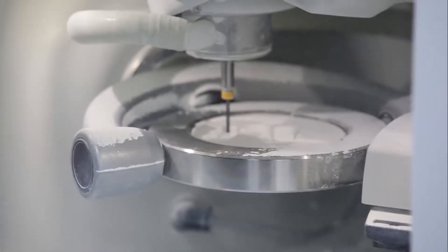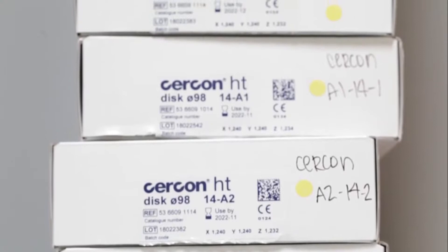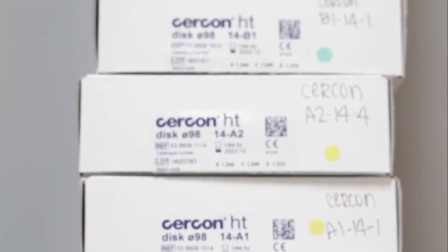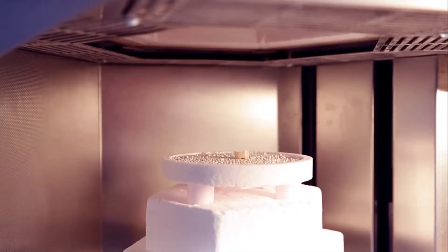So we decided to test out a lot of different materials in the market and find which one was the best fit for our laboratory. With the zirconia, what's really cool about it is that once we mill it, we can just put it straight into the oven and we don't have to worry about that. We just take it out, stain and glaze it, and that's it.